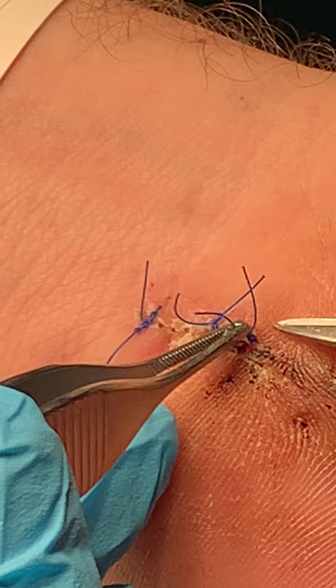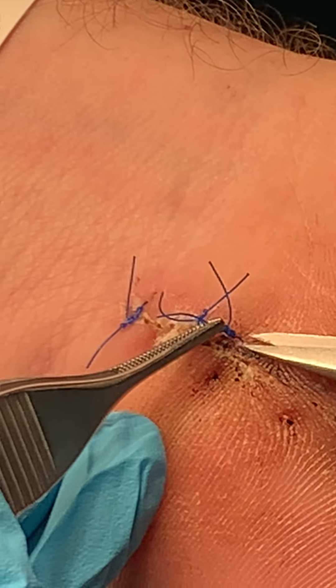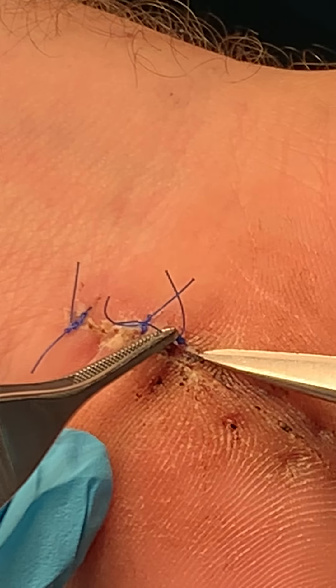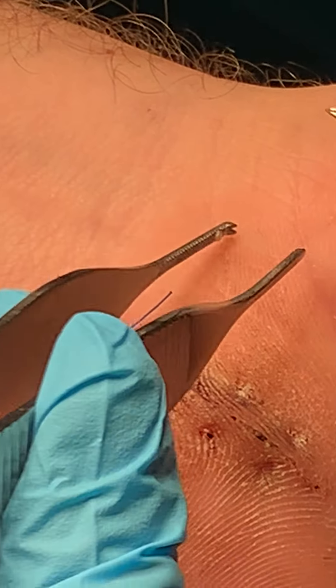And once again, this one — it's kind of hard to see that little bit, but when you pull hard you can see it. If I couldn't see it, I would still just start on the one end but take very, very small bites as I go towards it, and then it will come out all in one.